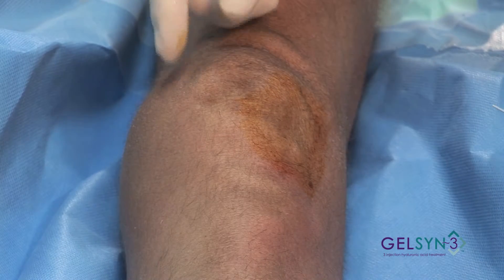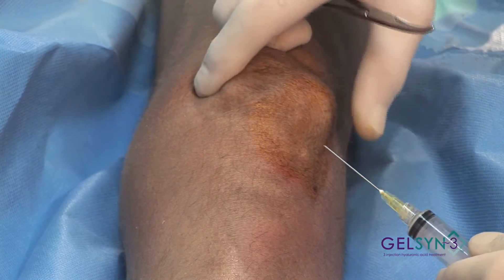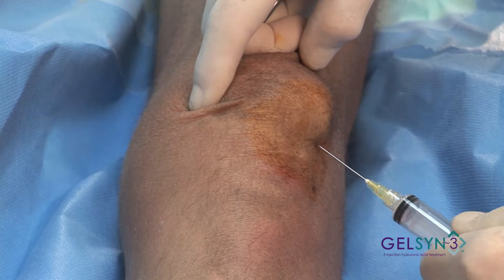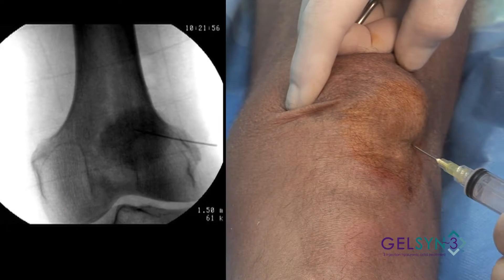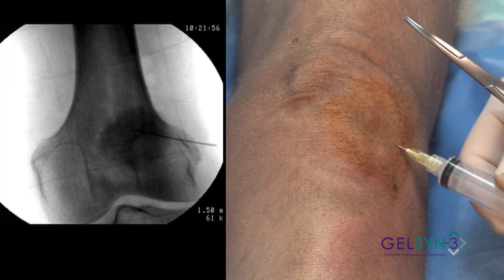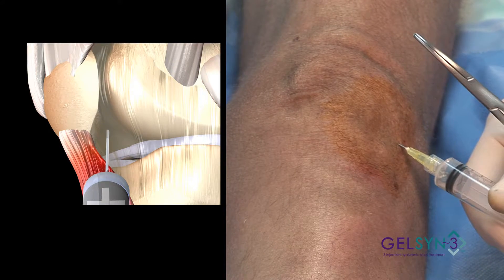with the patella subluxed, you can easily feel that lateral margin of the patella and insert this needle right into the joint space. And again, we aspirate the effusion.